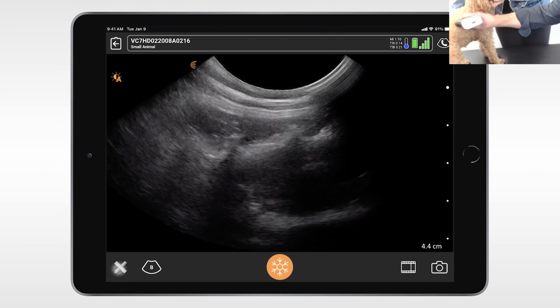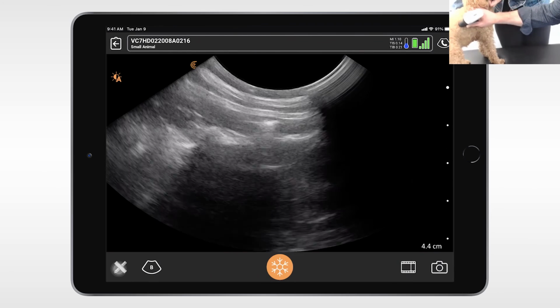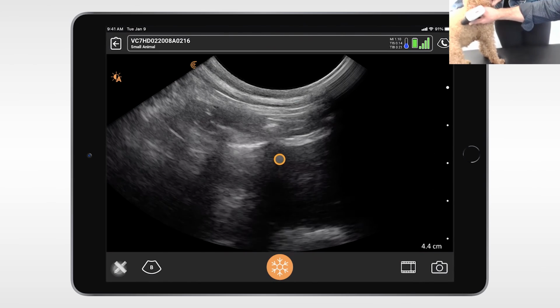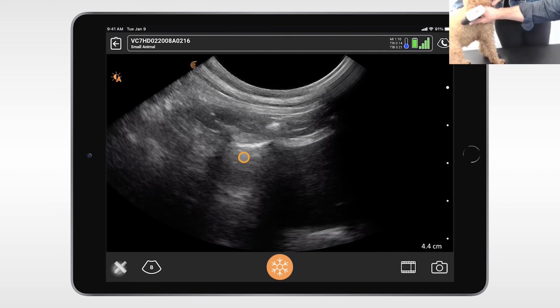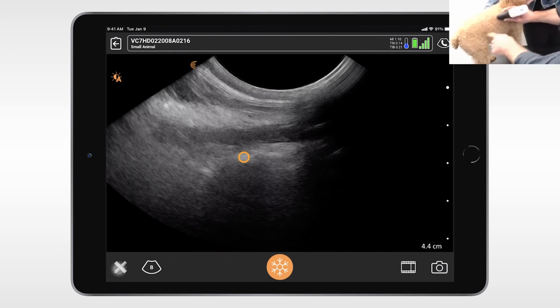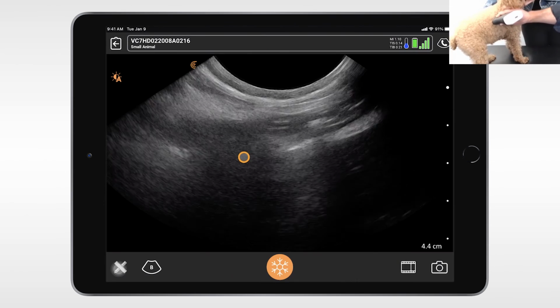Oh, yep. Here we go, Bourbon. There we go. And that's the reality of dealing with veterinary medicine. Your patients are often getting up and moving around, but that is something that we do. There's your curtain right there. There's my curtain right there. Yeah, there's the solid tissue and the lung. Okay, perfect. Great. And then from there, I would just do the zigzag down, follow the border and really follow all of that all the way in.